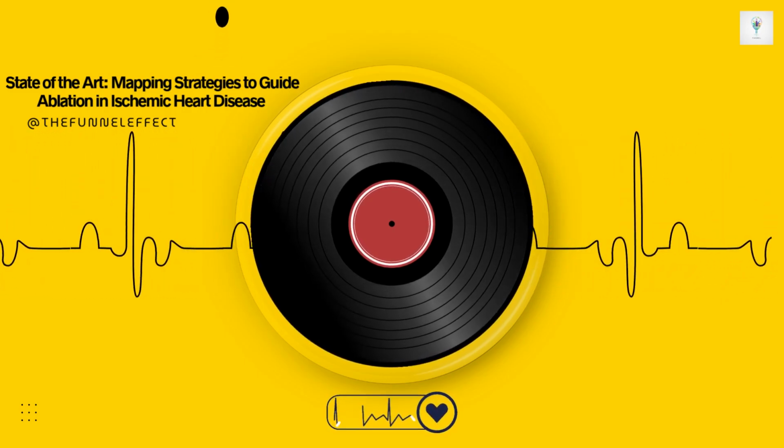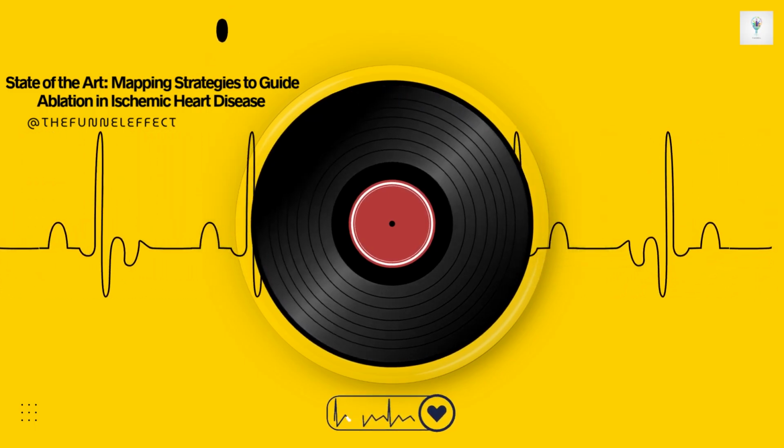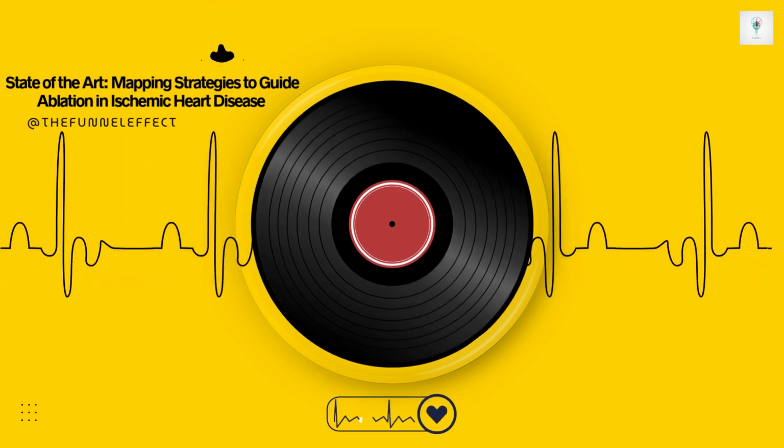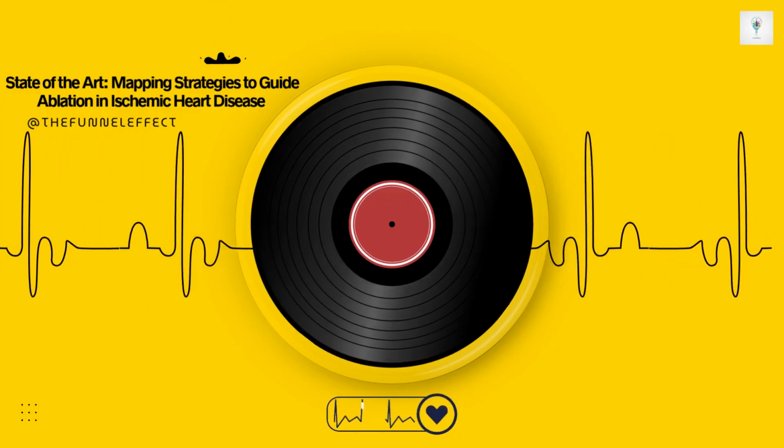Precisely. PS also helps distinguish this kind of scar VT from other possibilities, things like bundle branch reentry or VTs coming from the right ventricle. The review mentions it happens in up to 11% of these patients. You might miss those entirely without PS. That's interesting.